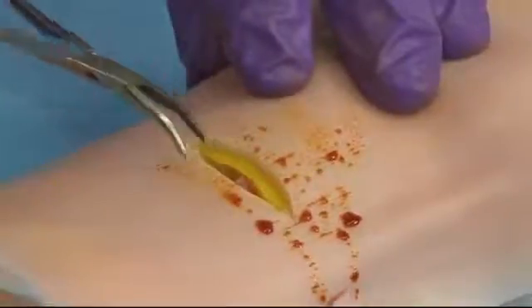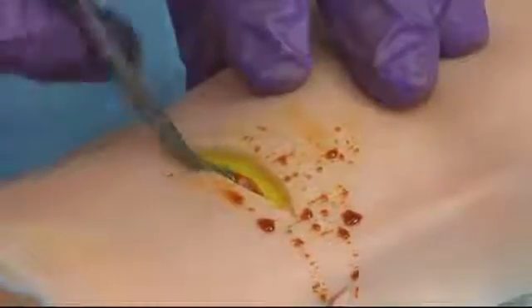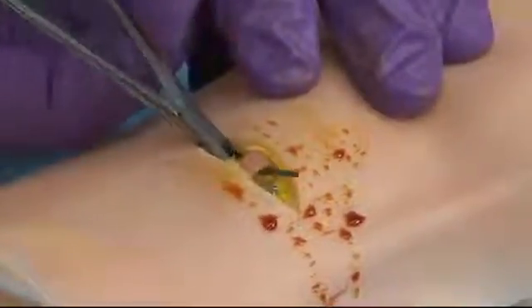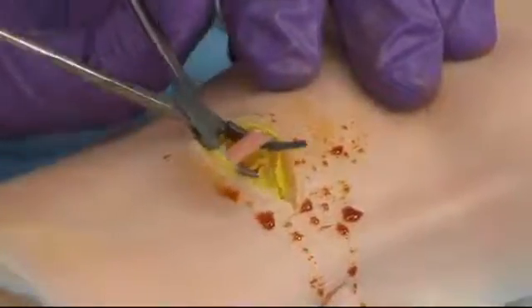Now what I'm going to do is use the mosquito clamp tips and turn them over 180 degrees and come under the vessel next to the bone and try to hook the vessel, as you can see I've done in this picture.